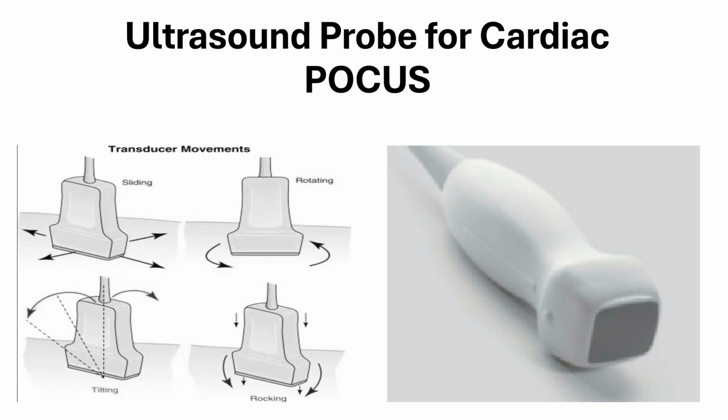With tilting, we adjust the angle of the probe while maintaining contact with the patient's skin. And with rocking, we tilt the probe back and forth along its long axis, at the same time maintaining contact with the skin. Please take a moment to review this slide.